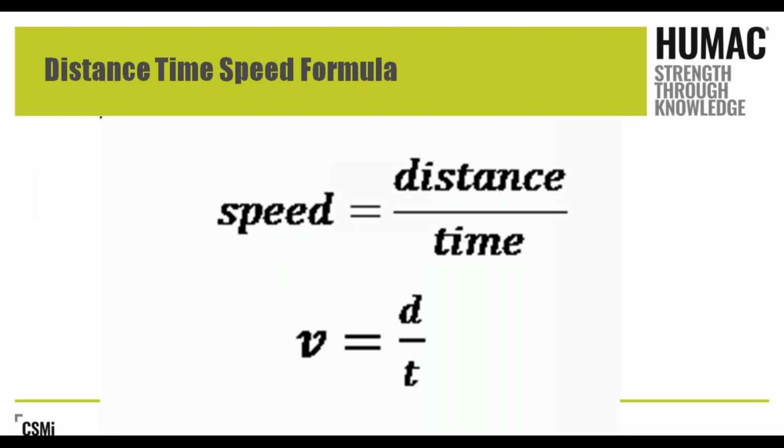If we're looking at time, it's distance over speed. And if we're looking at distance, it's time times speed. Now, the problem is that we never brought in that range of motion as a consideration when we started talking about high speed exercise. We just did 180 degrees. It didn't matter: 180 degrees, 210, 240, 270, 300.